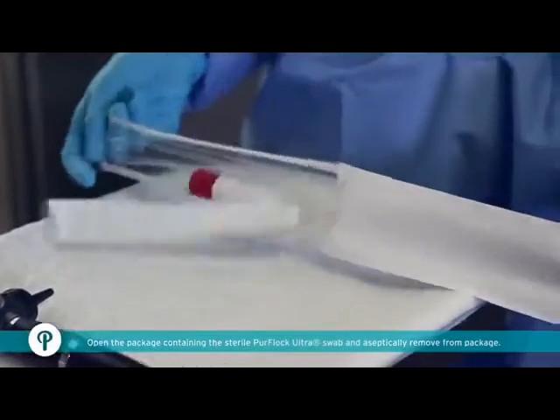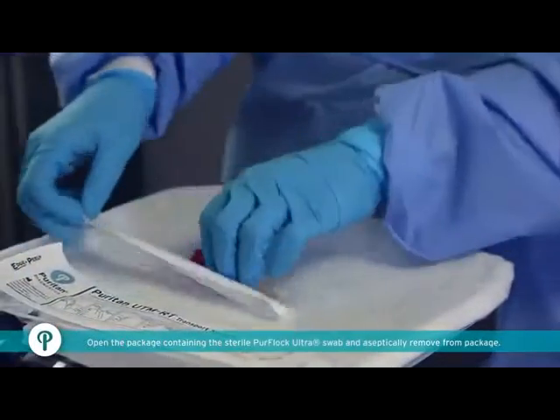Open the package containing the sterile PureFlock Ultra swab and aseptically remove from package.